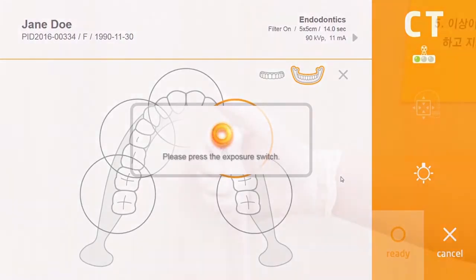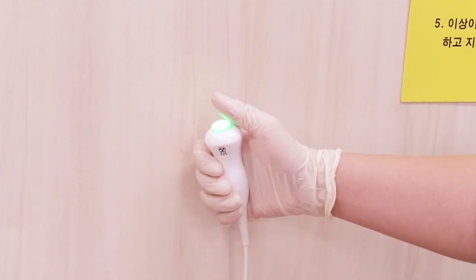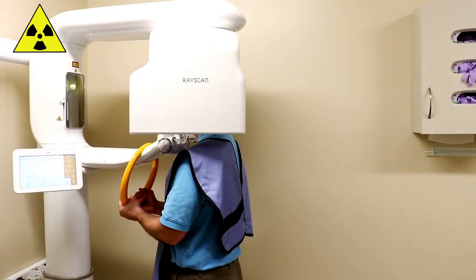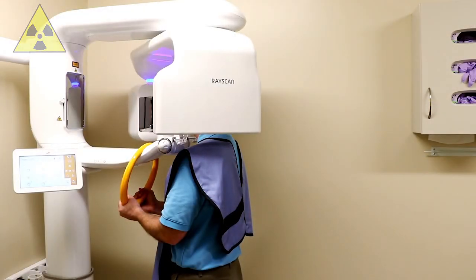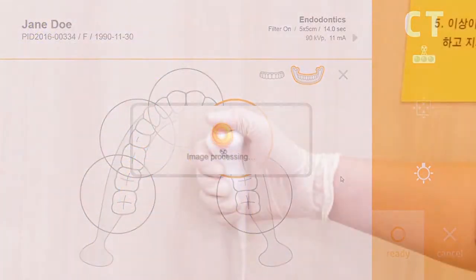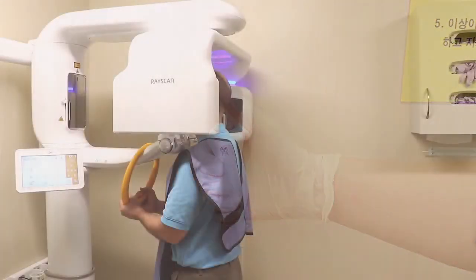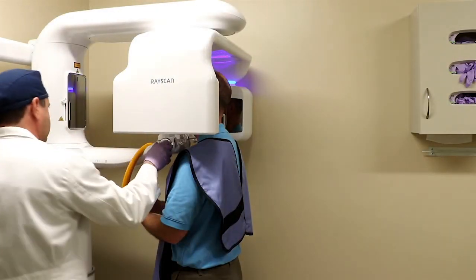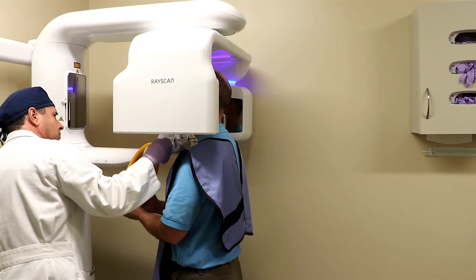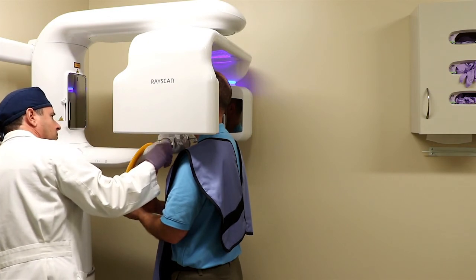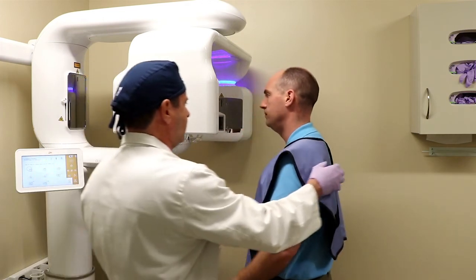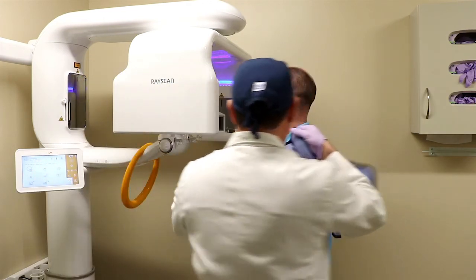Press and hold the exposure switch as instructed in the scanner program for the entire exposure time. Release the exposure switch when the rotation ends. Loosen the temple supports and instruct the patient to open their eyes and step back carefully.